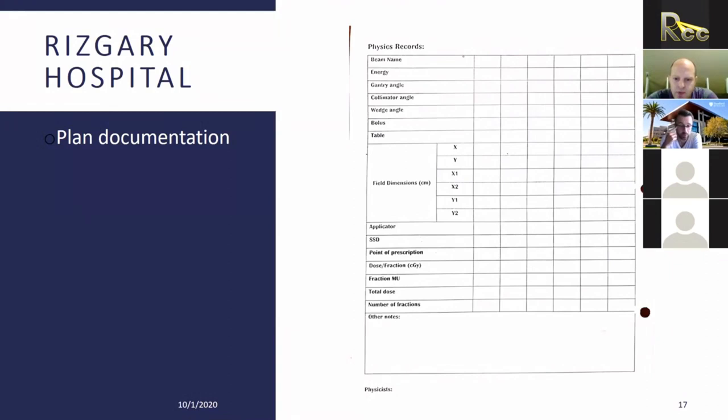A lot of the time, especially when you guys start moving into more complicated 3D treatment planning, there could be some notes that the planner needs to pass on to the therapist that wouldn't be captured at the simulation.